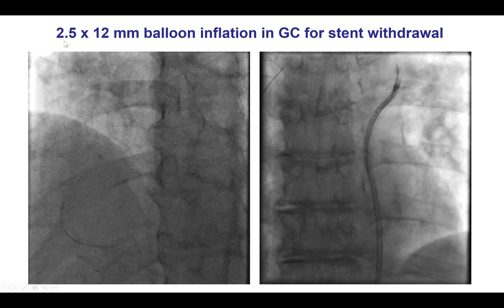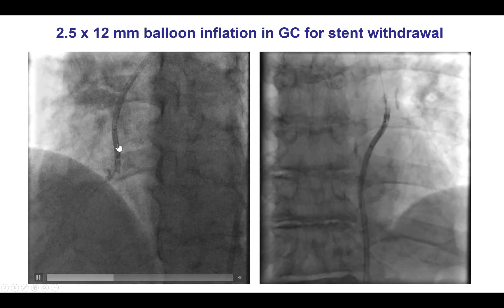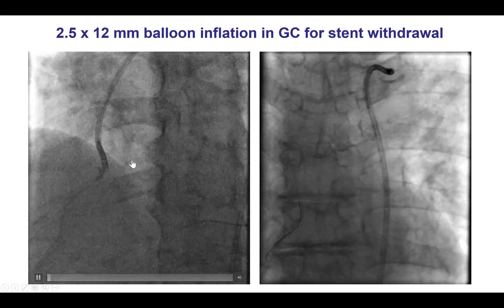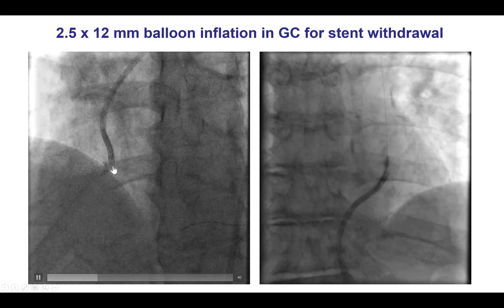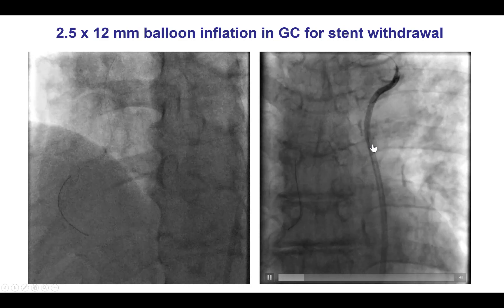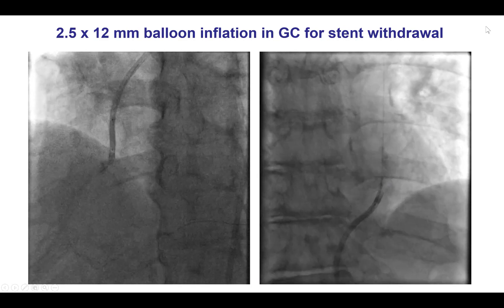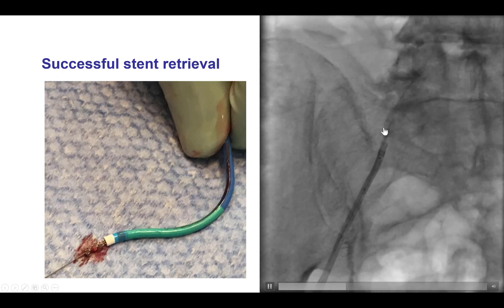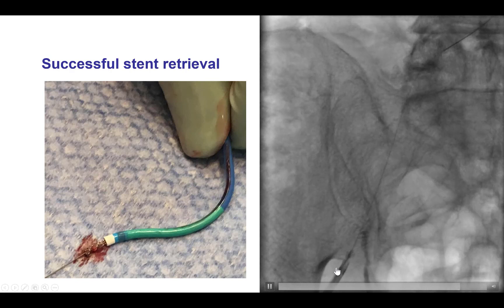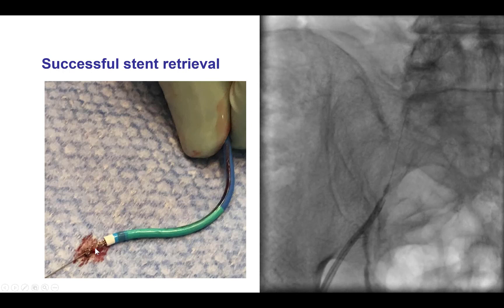After doing that, we advanced a small balloon inside the guiding catheter all the way to the tip and inflated it up to 20 atmospheres. After doing that, we were then able, under fluoroscopy, to remove the guiding catheter with the stent remaining on the guiding catheter as seen here. The stent, together with the guiding catheter and the inflated balloon, could then be retrieved all the way into the common femoral artery and outside the body.